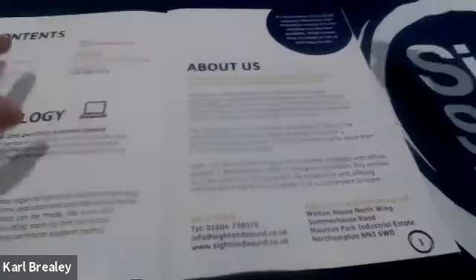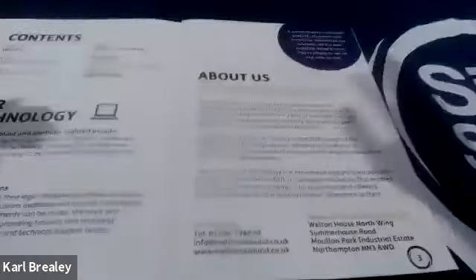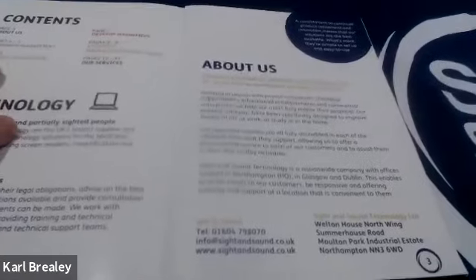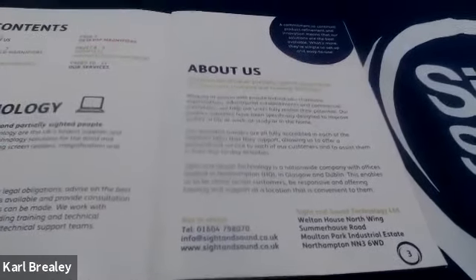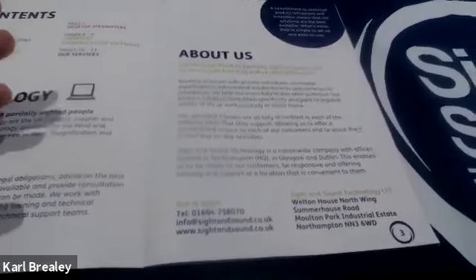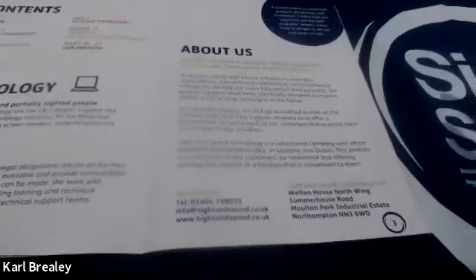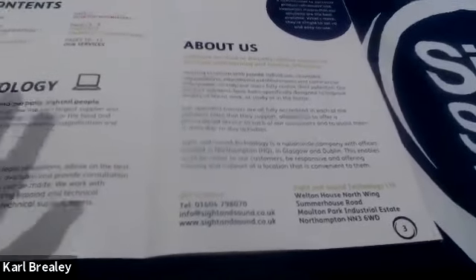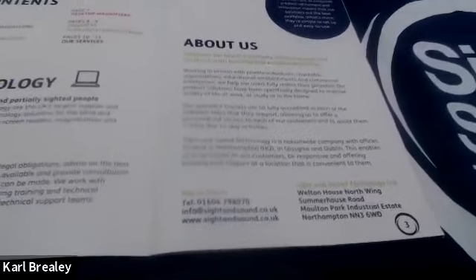Is it running off to the cloud to get feedback? No, everything's contained within the unit. The software is an OCR software. It'll be a mixture of various different softwares. I don't know if you're aware of OpenBook that we use. That's got a mixture of several different text-to-speech formats in there. It uses different companies' software, and that is running directly through the PC rather than going off anywhere. So it's not using any database that's cloud-based. It's using everything that's actually installed within the device. So if you're in an exam or anything like that, it'll only read what it sees. It has no ability to gather information from anything else.